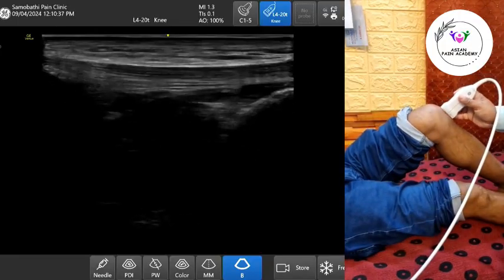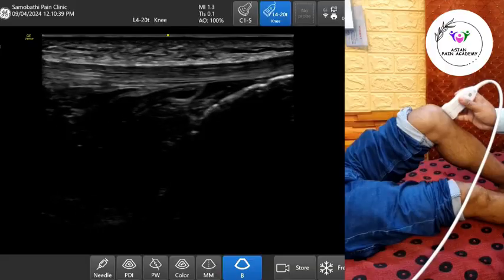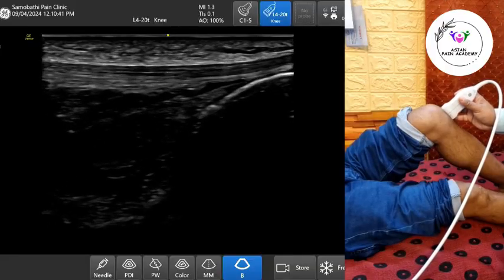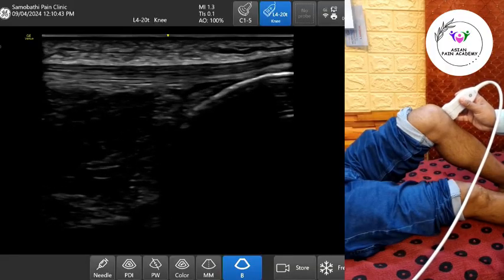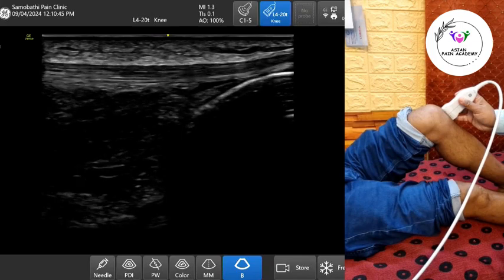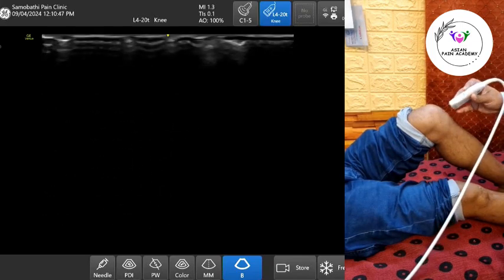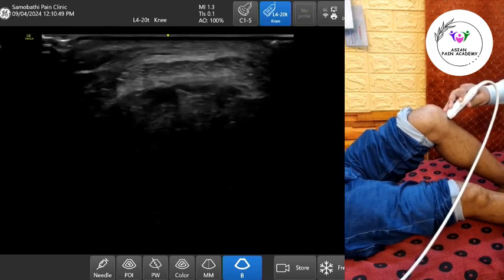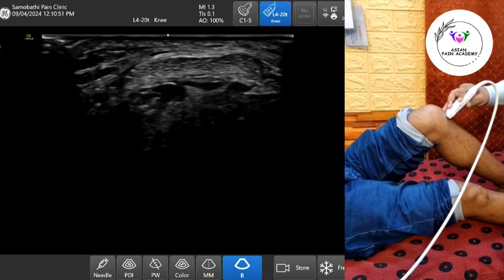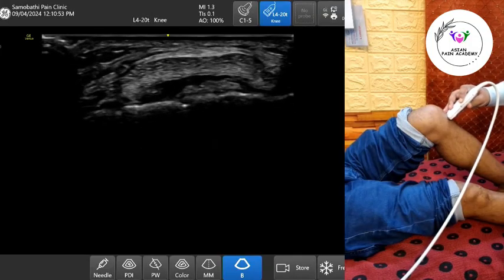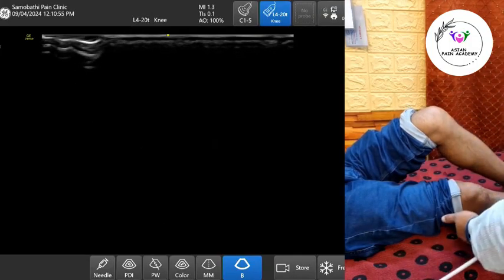Now let's walk through the scanning technique. Start by positioning the patient supine with the knee slightly flexed over a pillow to relax the tendon and improve visualization. Use a high-frequency linear probe, ideally 10 to 15 MHz. Apply gel generously to ensure full contact and good image quality.